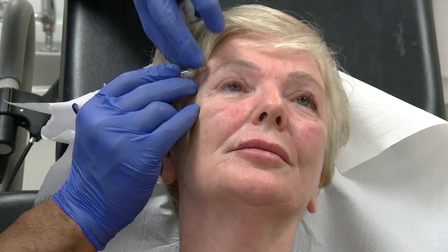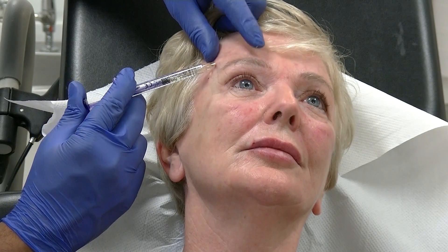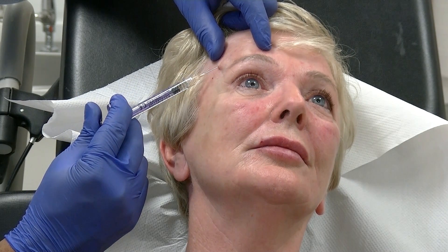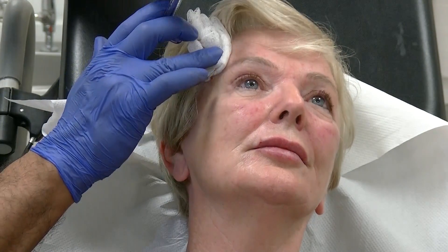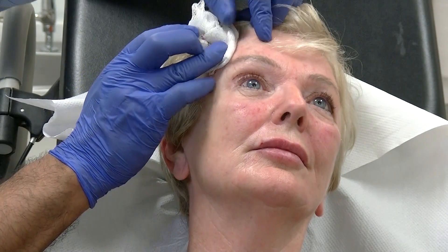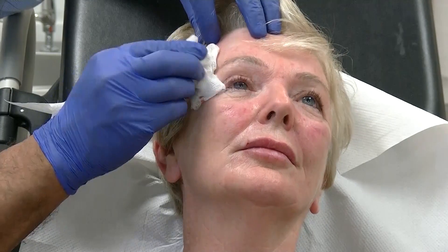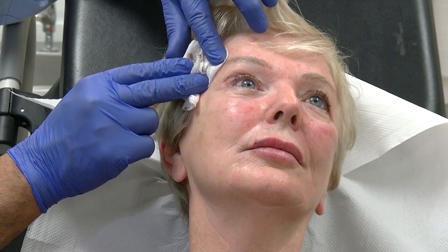As we go through that fascia, we elevate the brow — feel the end of my hand here — and hit the brow, and give half a mil there. Then mull that for any contour irregularities, and we just prevent any bruising from coming out by pressing on it a little touch.